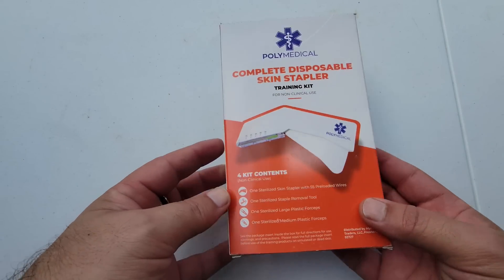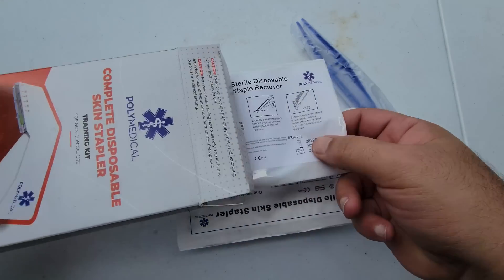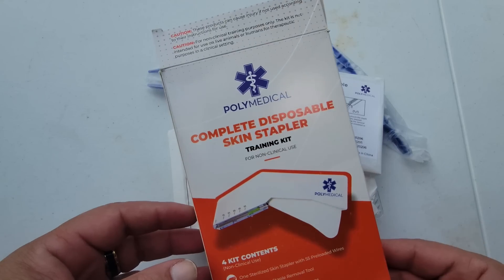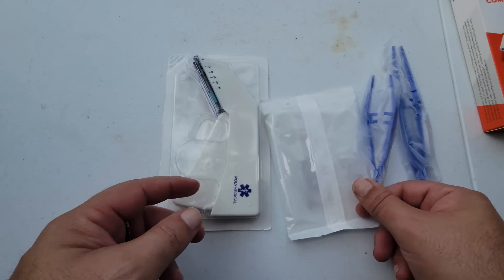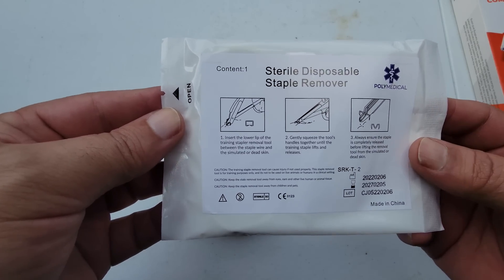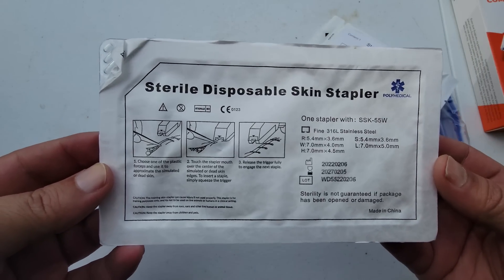First, we're going to open this box up and see what's inside — everything comes basically sterilized. Here on the counter you have your large forceps, your small forceps, and your skin staple remover. Everything you want to keep sterile; if you open it and plan on reusing it, you want to re-sterilize this equipment before use. The stapler here is also sealed in a sterile environment.